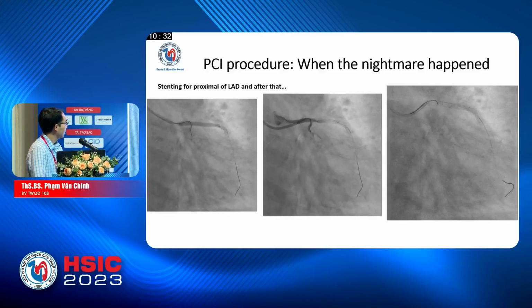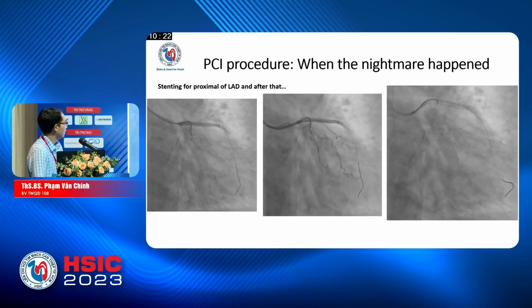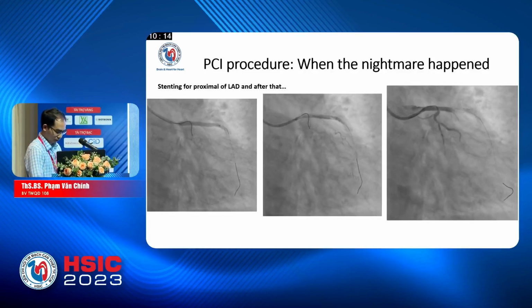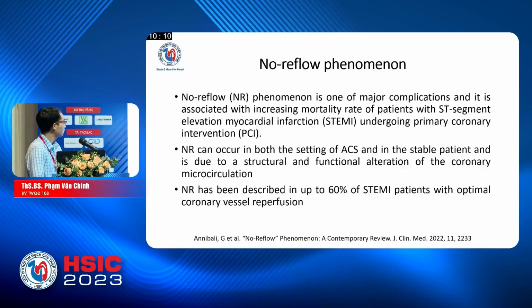And the story begins. When we were stenting the proximal LAD, you can see the no reflow phenomenon, and the heart rate of the patient went down quickly, and the blood pressure also became very low. So the patient had the no reflow phenomenon.